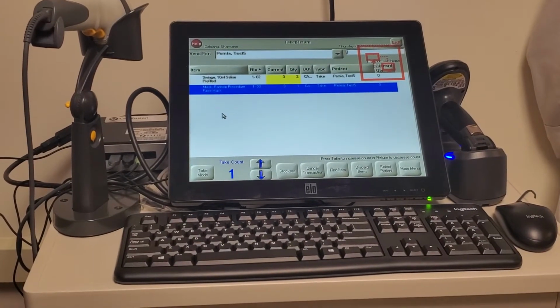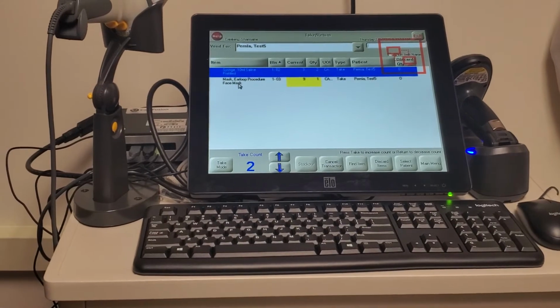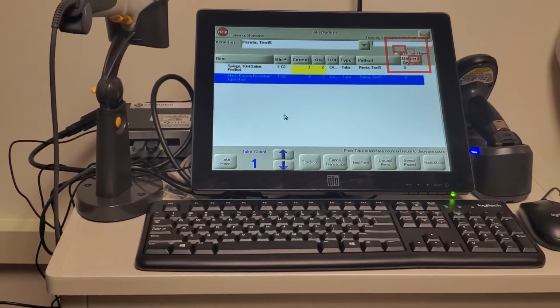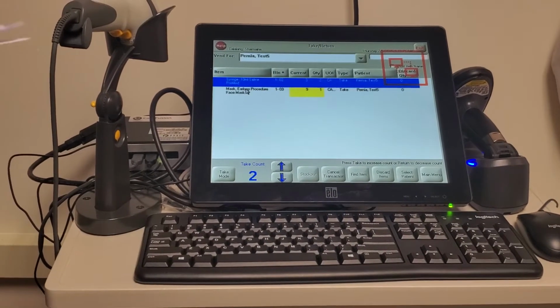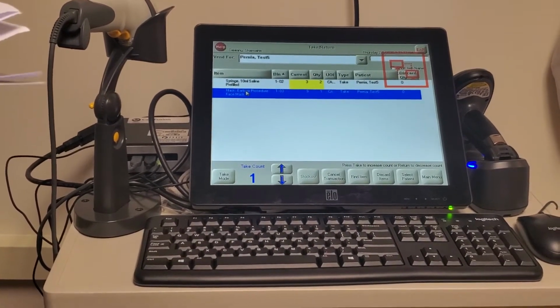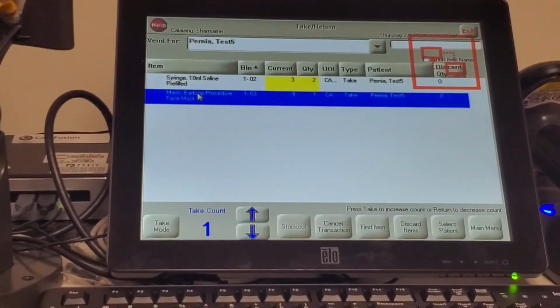Okay, that sounds a little bit better than when we first started. I think Jen is right. If you have the cart, you can put it all together right there. Like Jen is talking about, the five patient rooms. You already scan it, and then you can just go to the rooms. So it needs to be scanned before they leave this room? Yes. That's going to drop the charge. Yes. Then no need to do the manual.